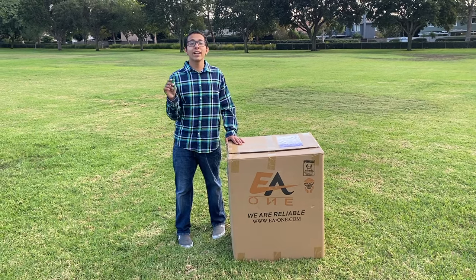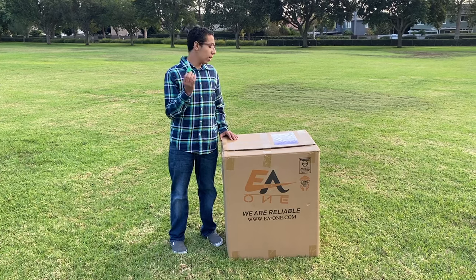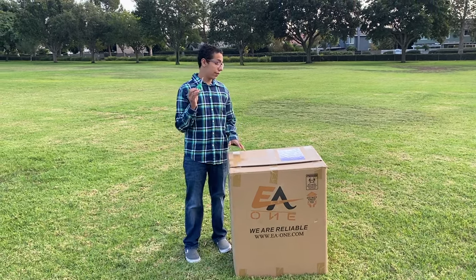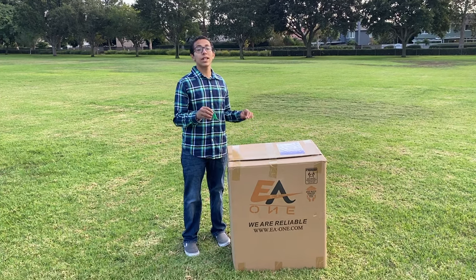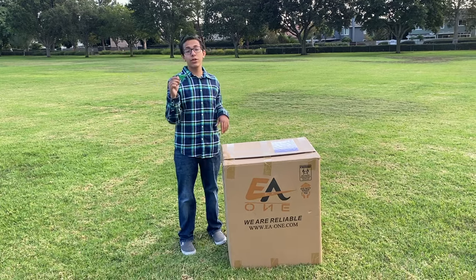Hello everyone, this is the EA1 Electric Wheelchair Company. Today I'm going to be showing you the automatic folding wheelchair. Not every wheelchair is automatic — our feature is that this automatically folds and is also remote controlled, so you can take it from here to there with your remote control.